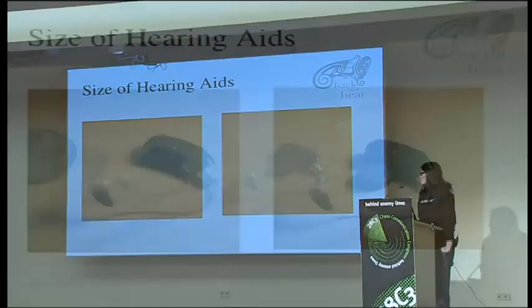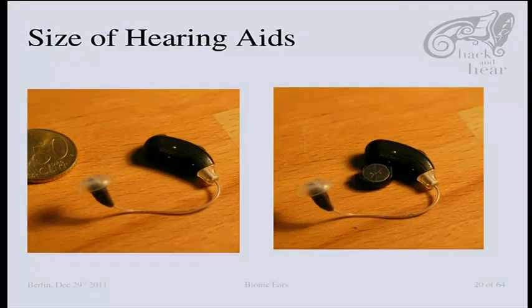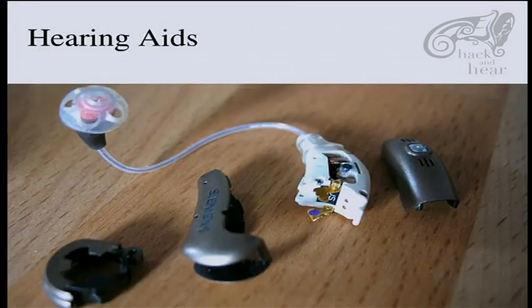Yeah, they also got pretty small. This is an example of my hearing aids with a 50-cent piece to have an impression of the size. And you can see that actually half of it is used by the battery compartment. Out of curiosity, I took my hearing aids apart.